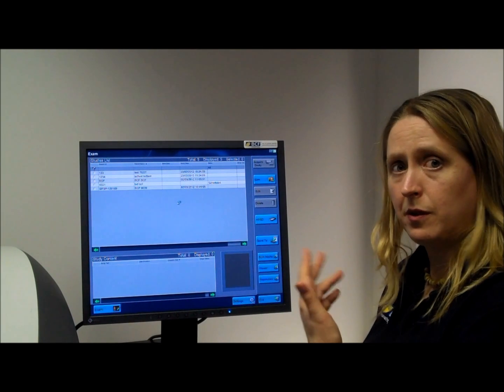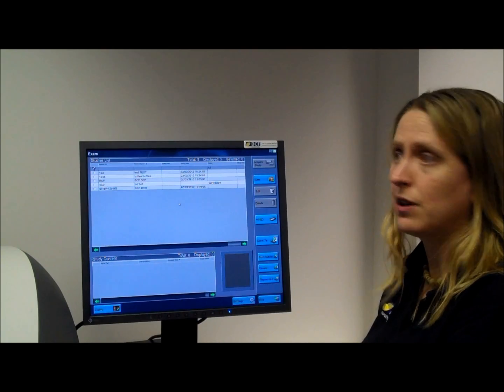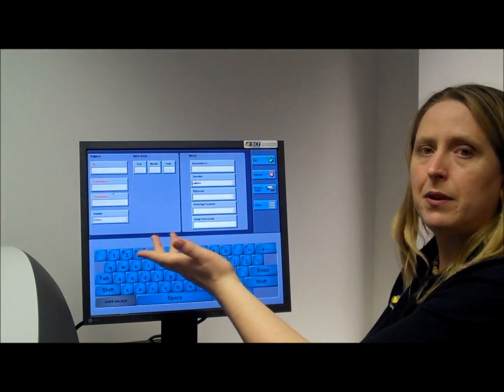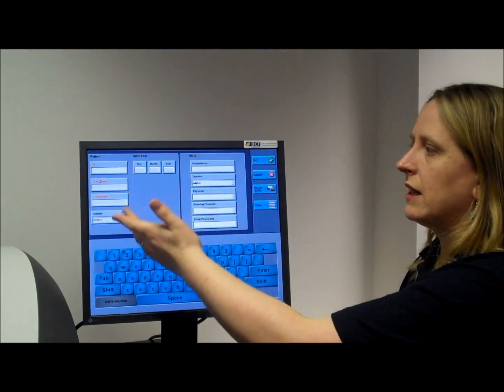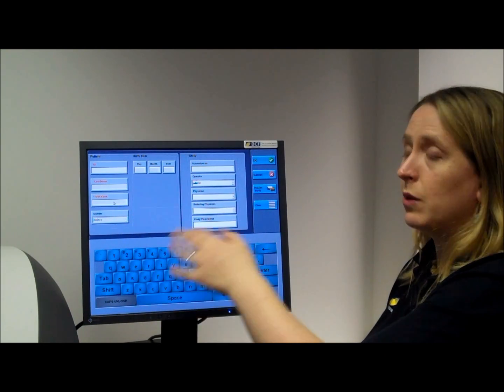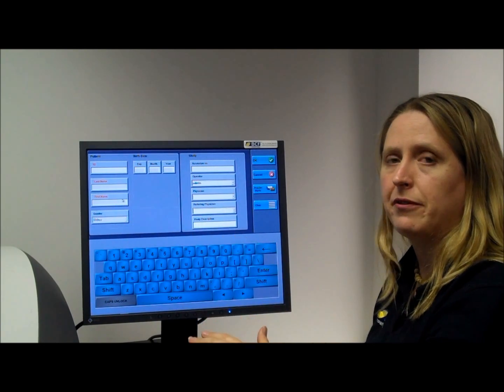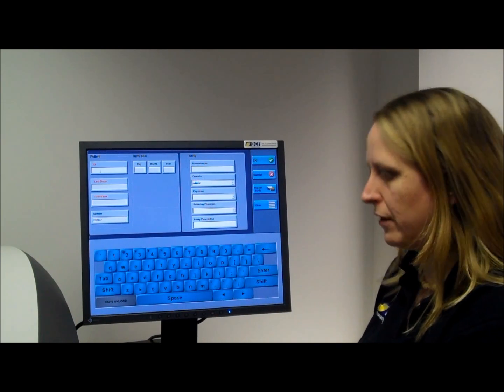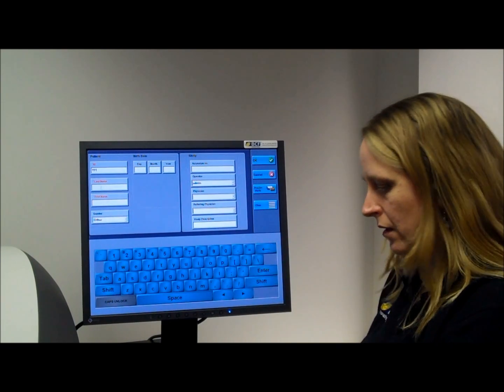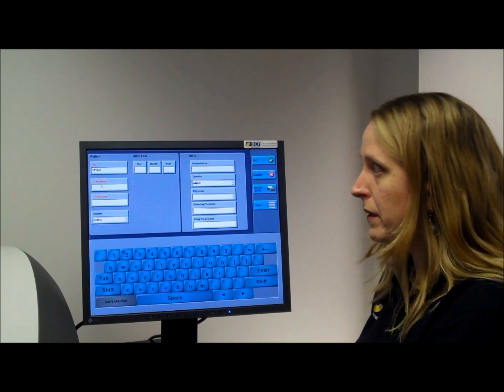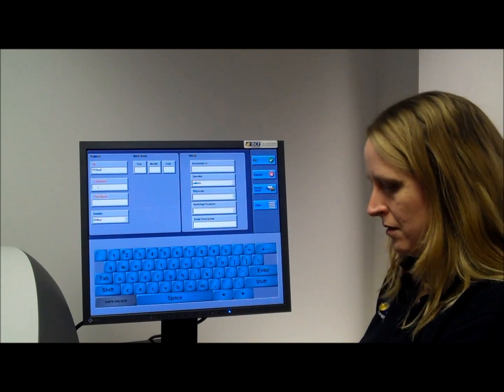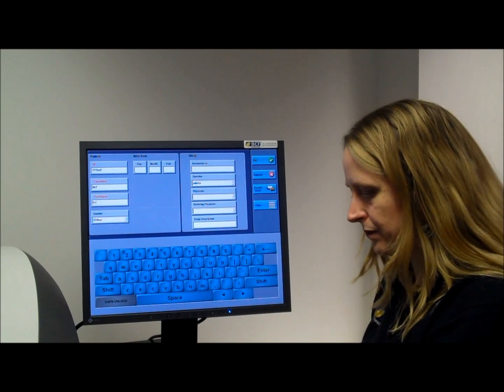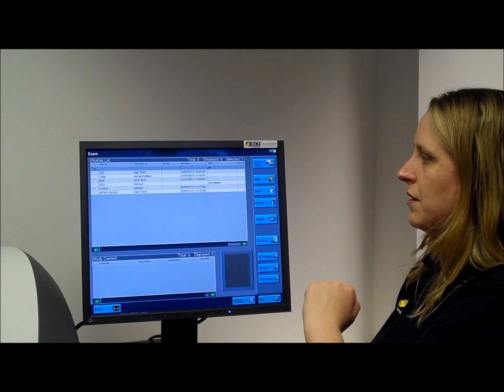If you want to input a new patient because you've got some x-rays you're taking, just hit new, and then input the patient's ID, last name, first name. We tend to have these set to be required fields, and we can add other things in to be required fields too. So we'll go for BCF-BCF for this patient, and then just hit require study.